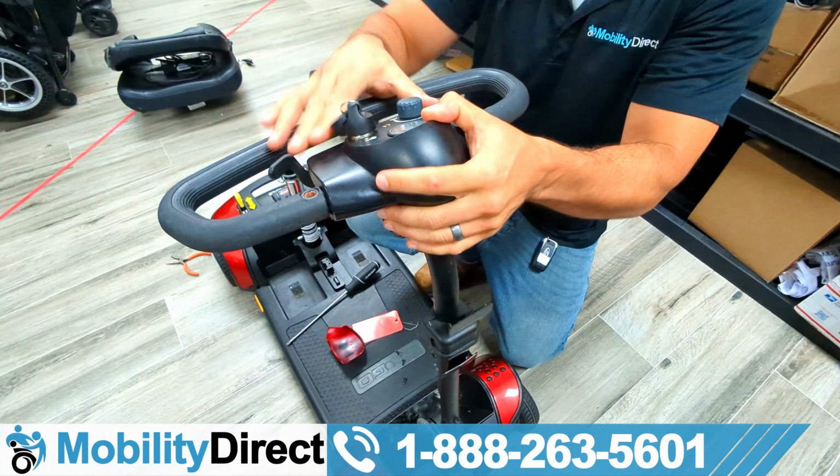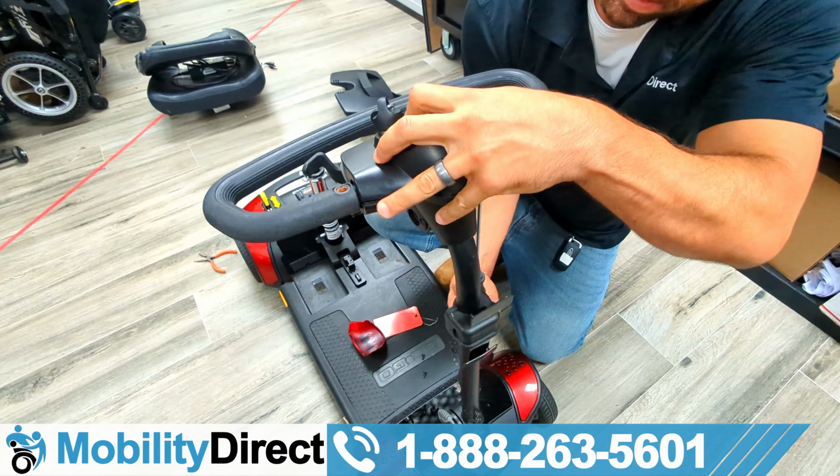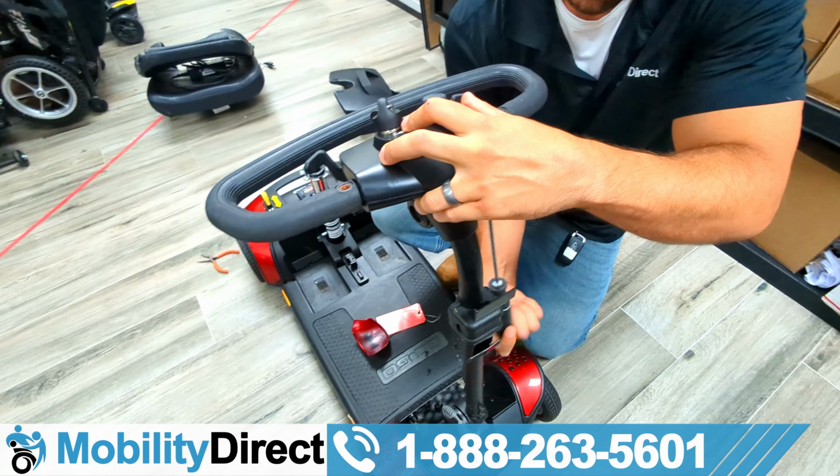So you can see now I'm going to go ahead and proceed with reinstalling and tightening the additional 4 screws and everything from here on in is pretty smooth sailing.